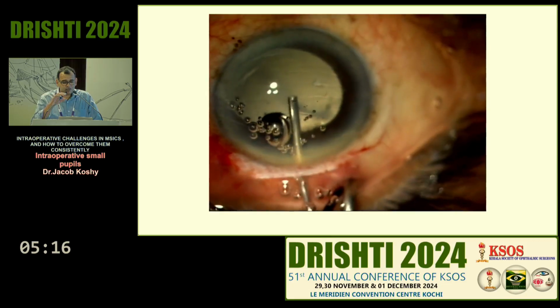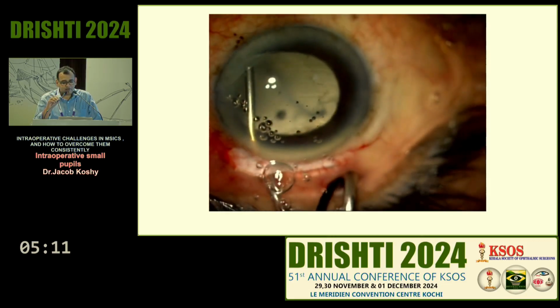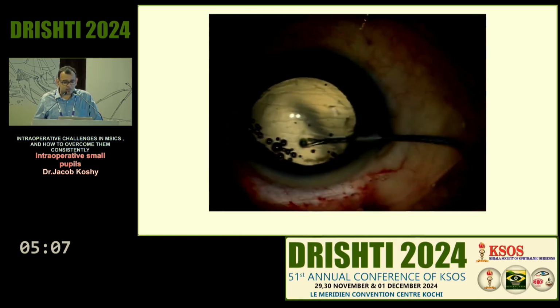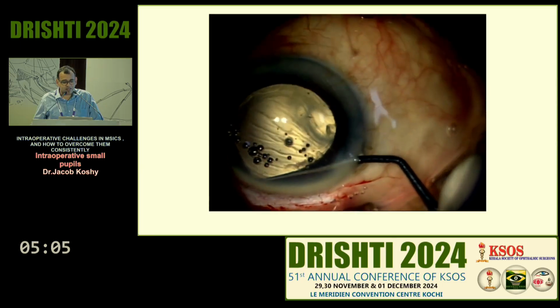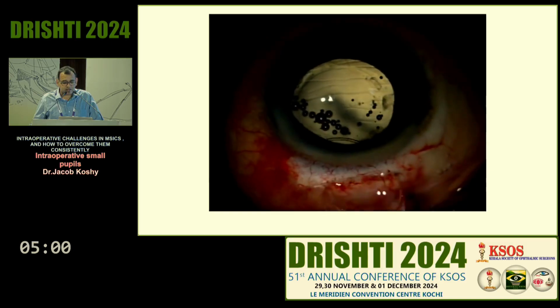Now, once you have done an adequate vitrectomy and you've cleaned up adequately, now here you're definitely planning to put the lens in the sulcus. Remember to inject the viscoelastic under the iris and above the anterior capsule. And again, just check all around if there is adequate support.